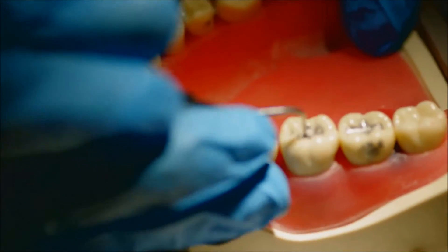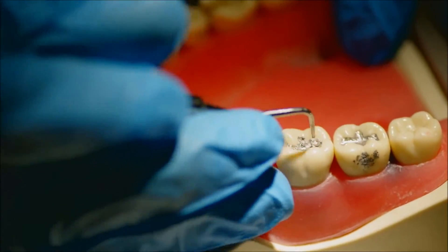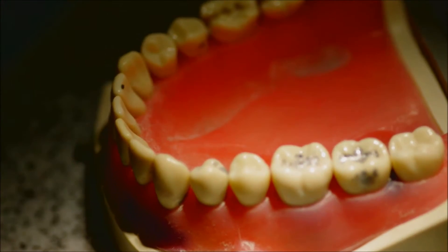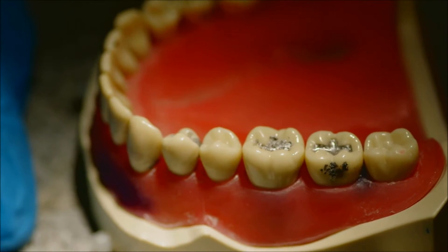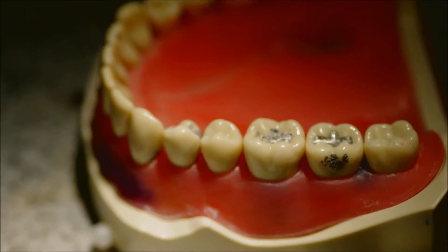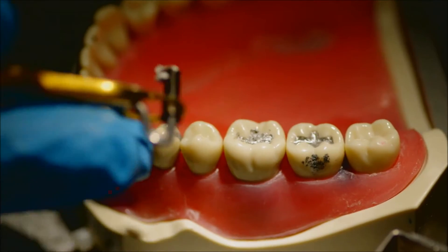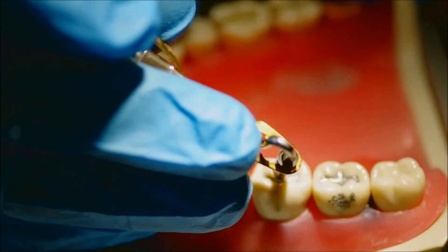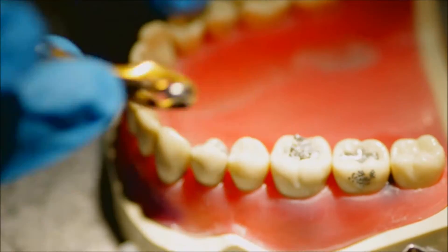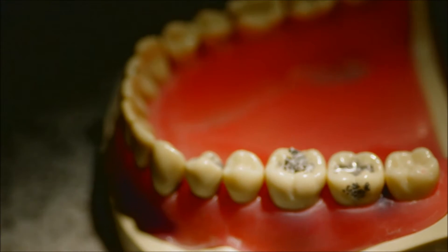You just want to get most of the floor, maybe about half the height of your prep. We're going to do a second layer right now, and then we're going to use a larger condenser to ensure that the amalgam is pressed firmly against your margins and you have a nice seal.